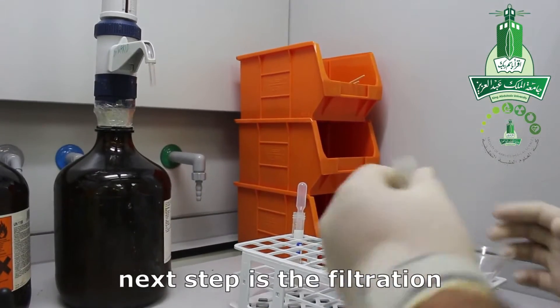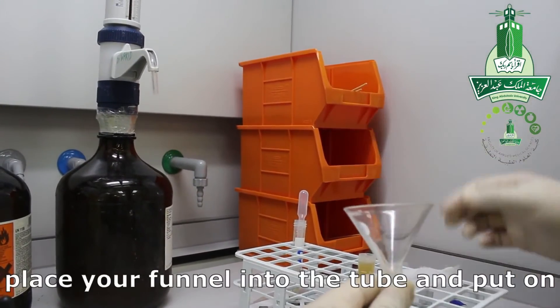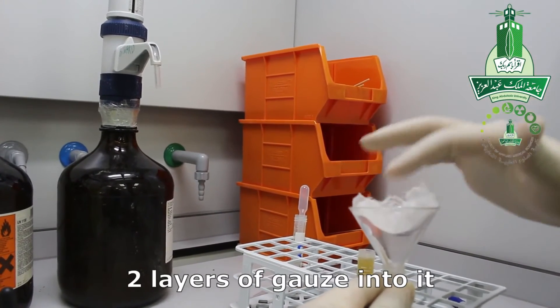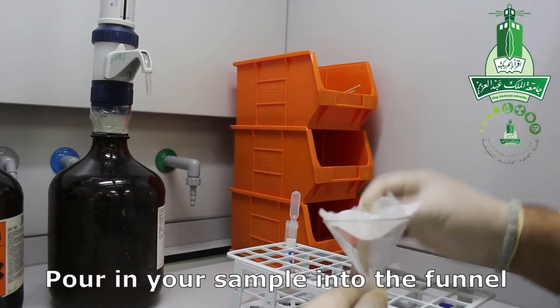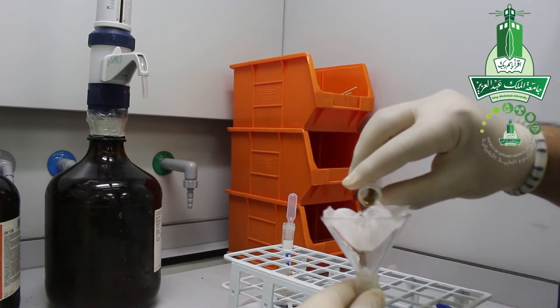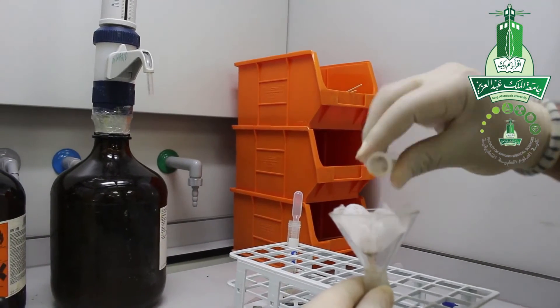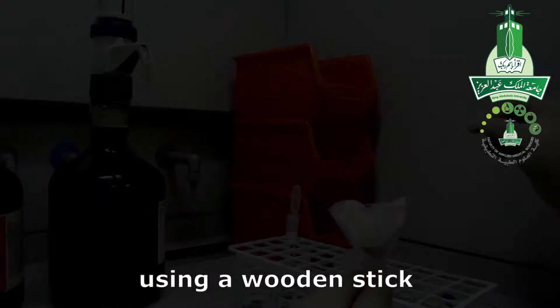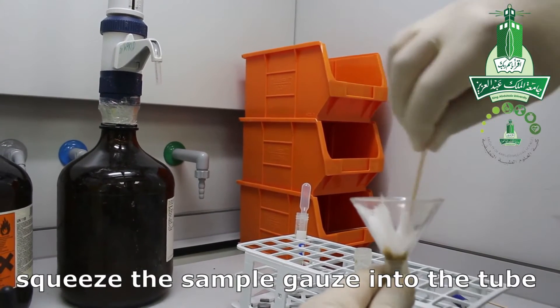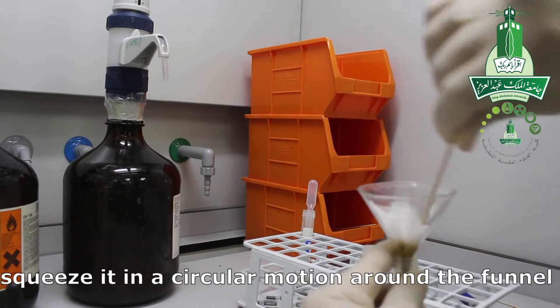The next step is filtration. Place your funnel into the tube and put two layers of gauze into it. Pour your sample through the funnel into the second tube. Using a wooden stick, squeeze the sample gauze into the tube in a circular motion around the funnel.